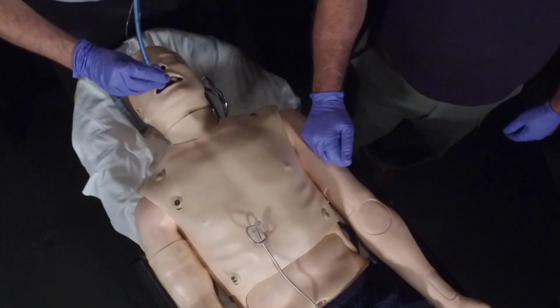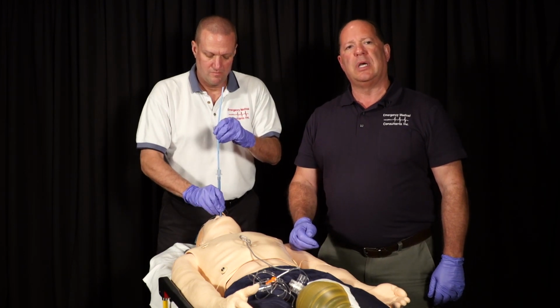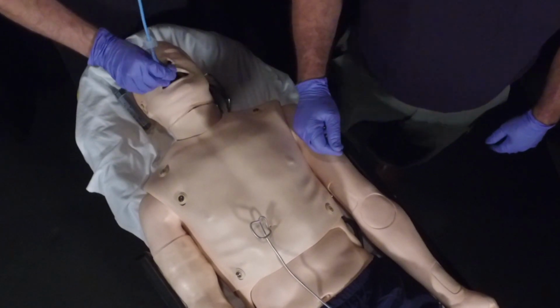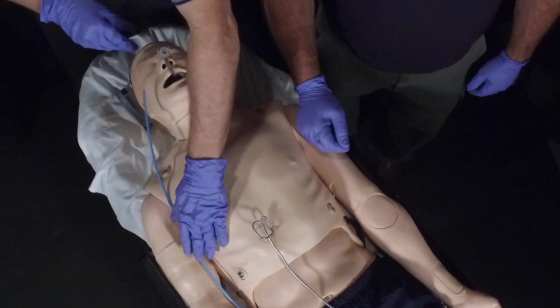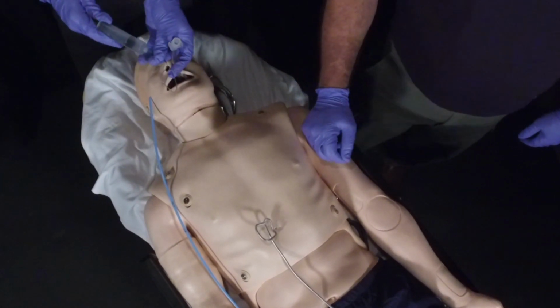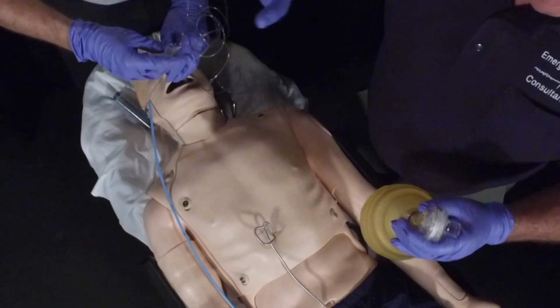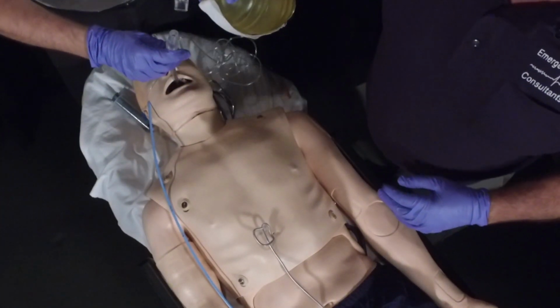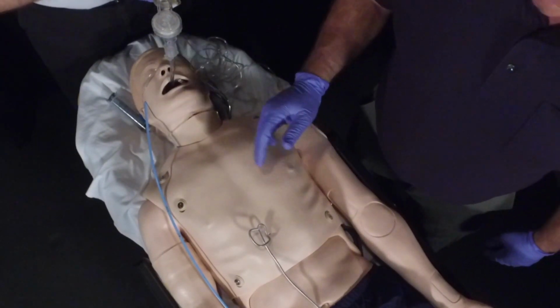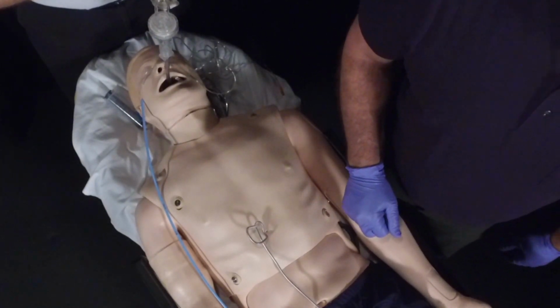Once we feel that, slide the tube down the back of the throat. Keep the tube beveled end along the base of the tongue so it slides down there. You've now just guided the tube into the trachea by feeling your way in. At this point, inflate the cuff, use your end-tidal CO2, bag valve mask, listen to epigastric sounds, lung sounds, chest sounds, end-tidal CO2 monitoring just like you would with any other intubation.